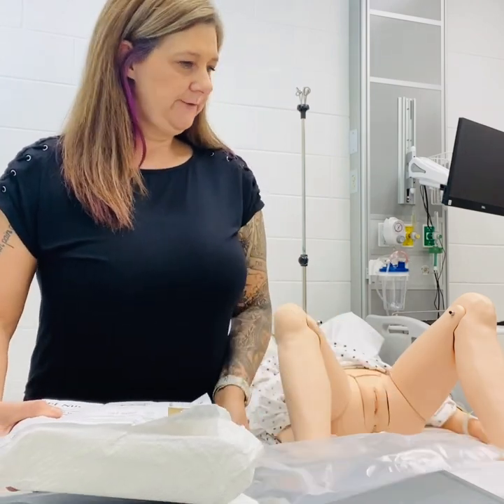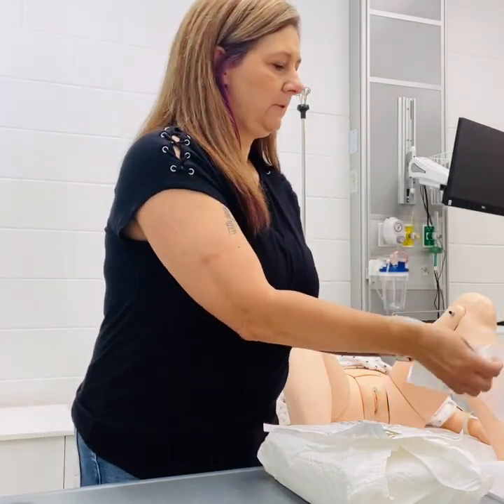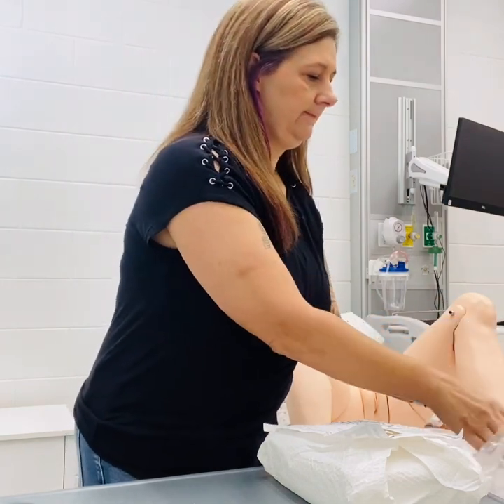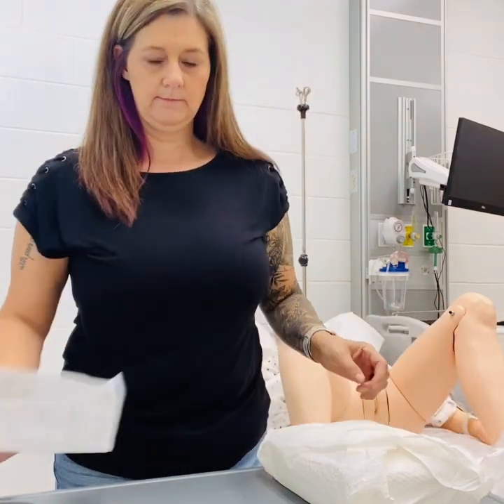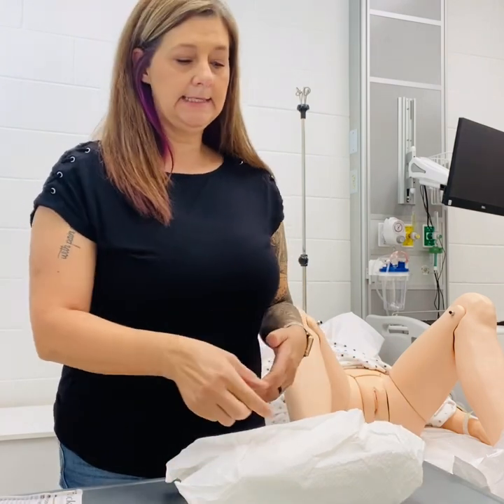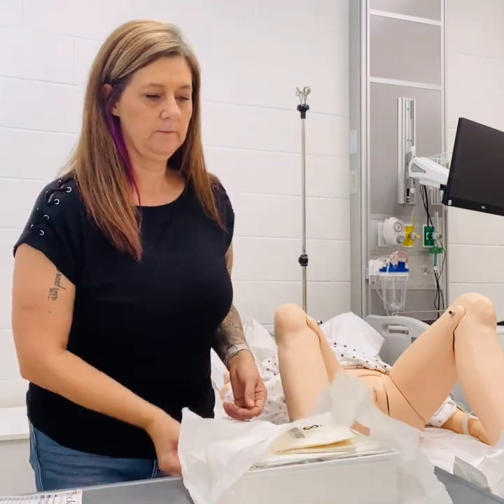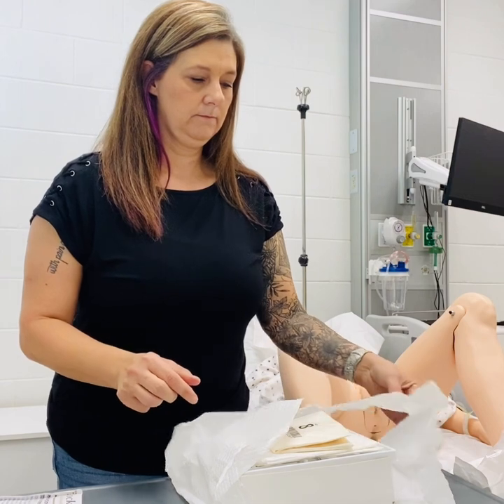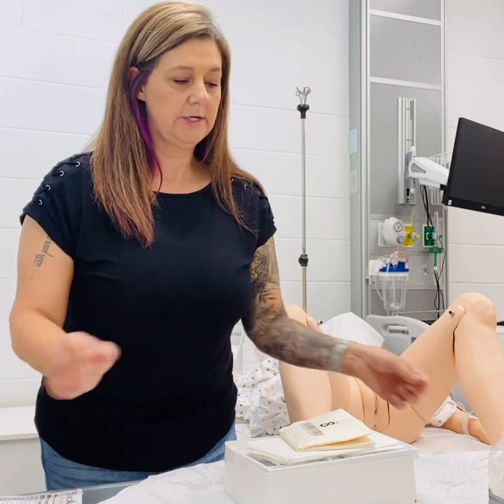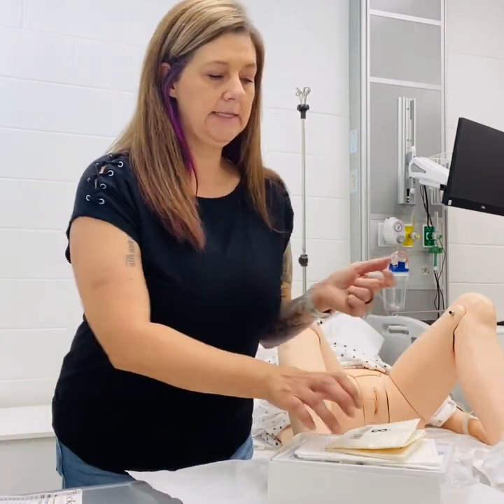You'll open your package. This is sterile, so I'm going to start opening this package away from me. And we have our sterile gloves. I'm going to go ahead and begin by putting those on.